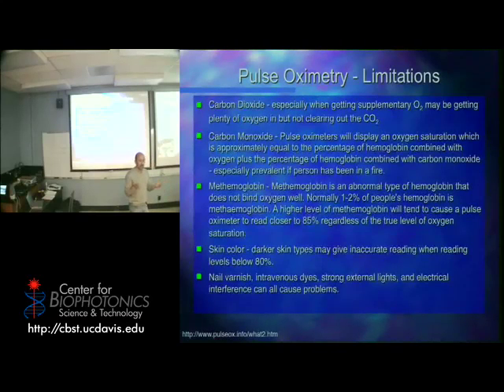Now, are you measuring oxygen, or some other property, with the pulse oximeter? Are you measuring oxygen? The color of the oxygen. So are you measuring oxygen? You're measuring bound oxygen to hemoglobin. There could be other oxygen in your blood. I could have a little thing on the side that's pumping oxygen into your blood. It would probably interact with the hemoglobin because the hemoglobin likes the oxygen. But if it didn't, I can't measure that.